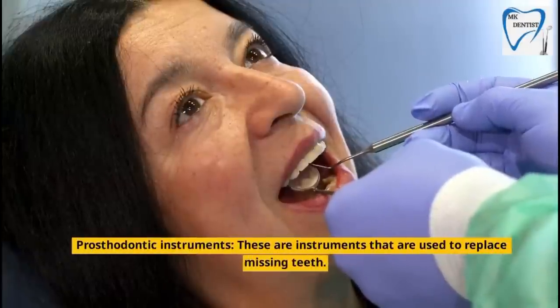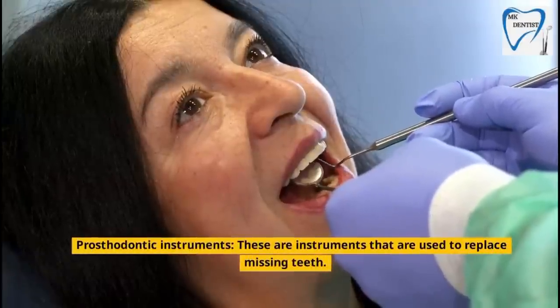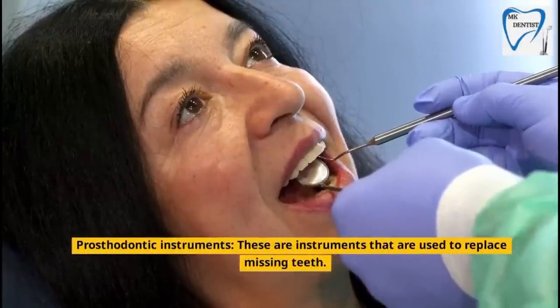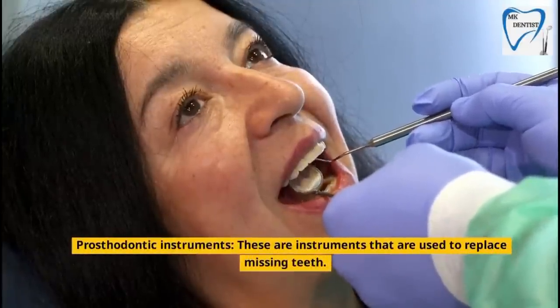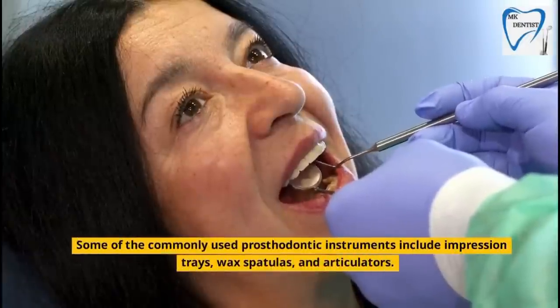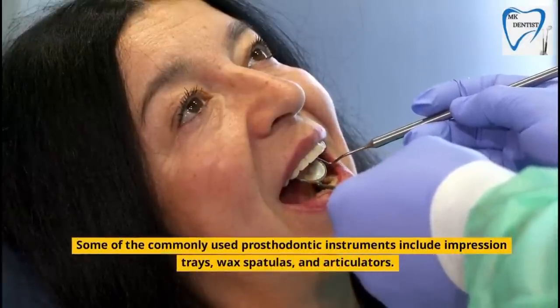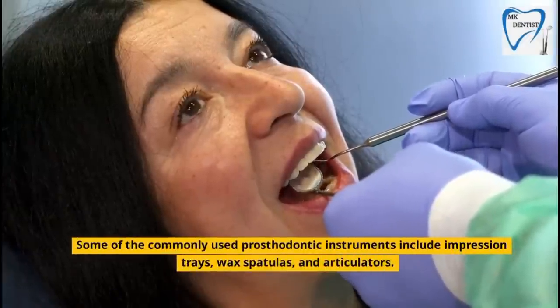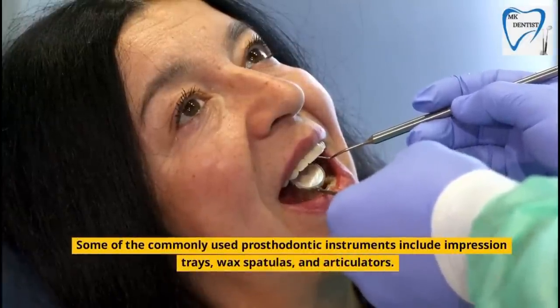Prosthodontic instruments are instruments that are used to replace missing teeth. Some of the commonly used prosthodontic instruments include impression trays, wax spatulas, and articulators.